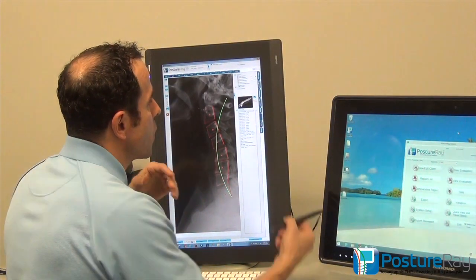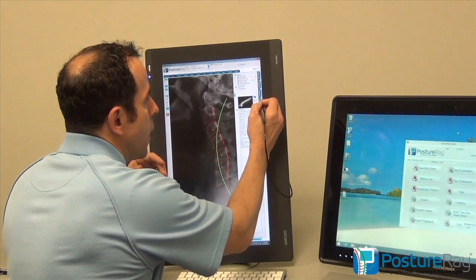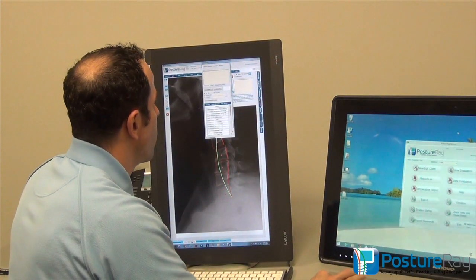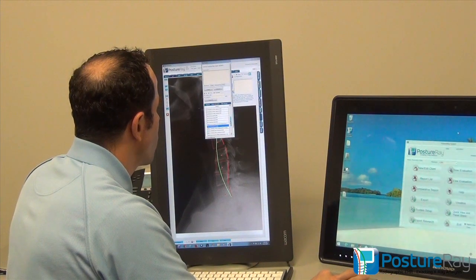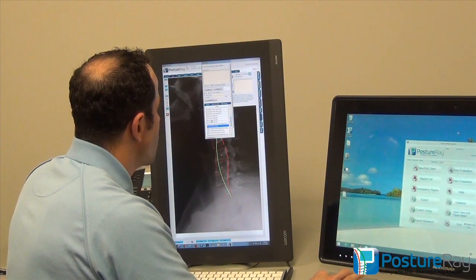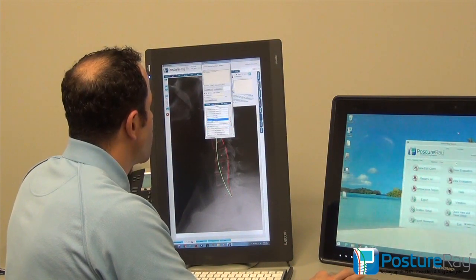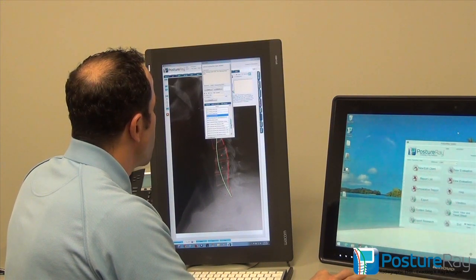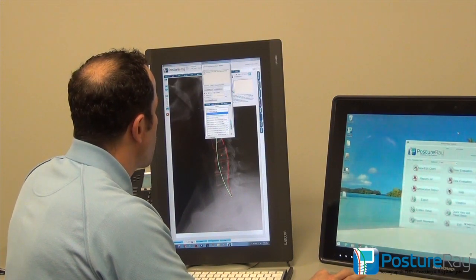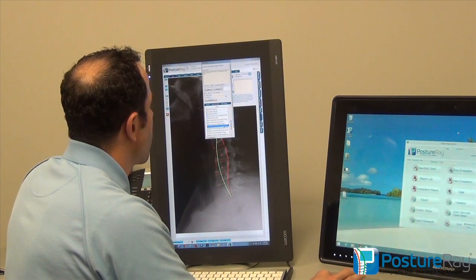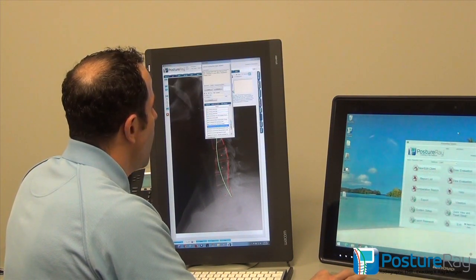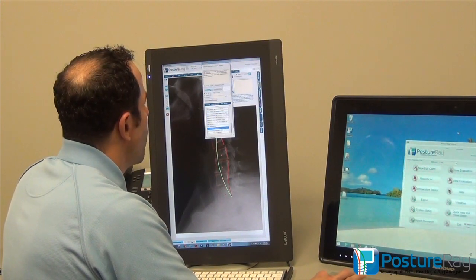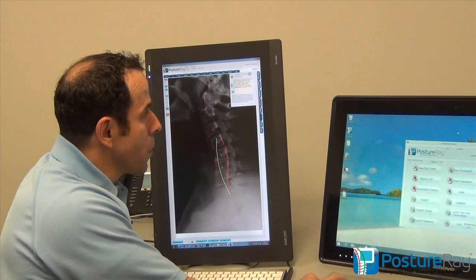So what I'm going to do is come up here and use impressions. I already had predefined impressions, but I could come in here and say, okay, there's disc space thinning noted at C5-C6 and C6-C7, and there are moderate to severe diffuse degenerative changes noted, and I don't see any fractures. So now I'm done with that pathology report.